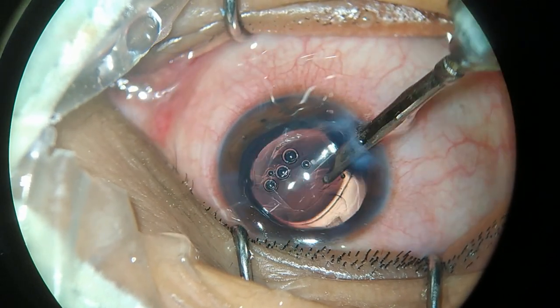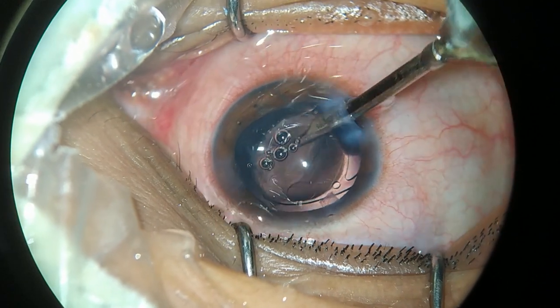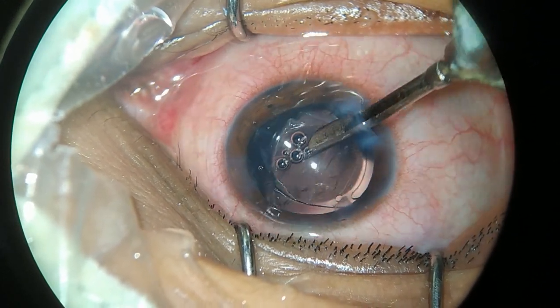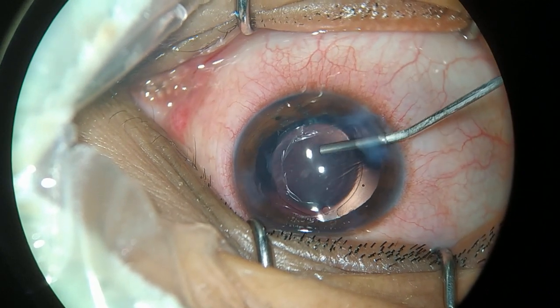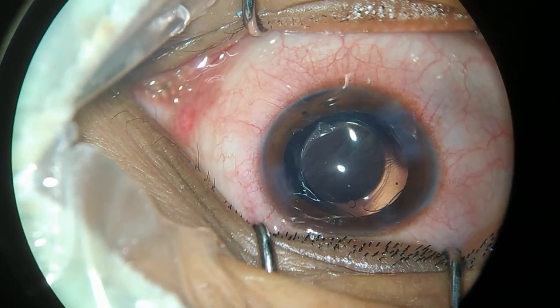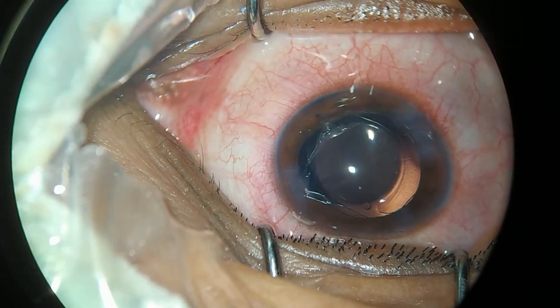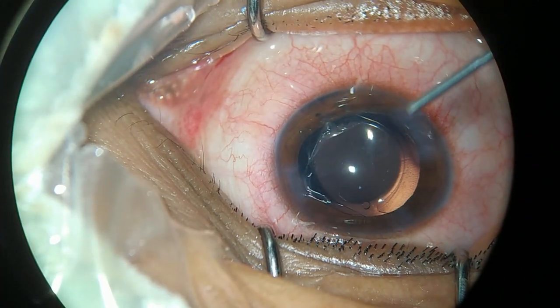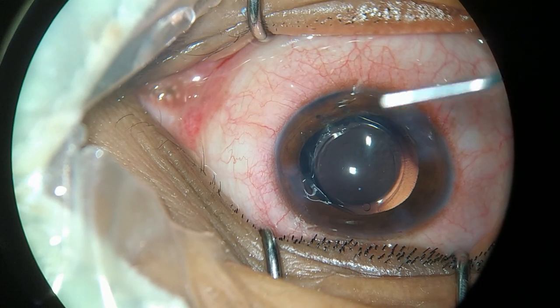Now that the cataract surgery is completed, we move on to correct the iridodialysis. First, the pupil is constricted using intracameral carbachol. We have chosen to use a sewing machine technique for the iridodialysis repair.